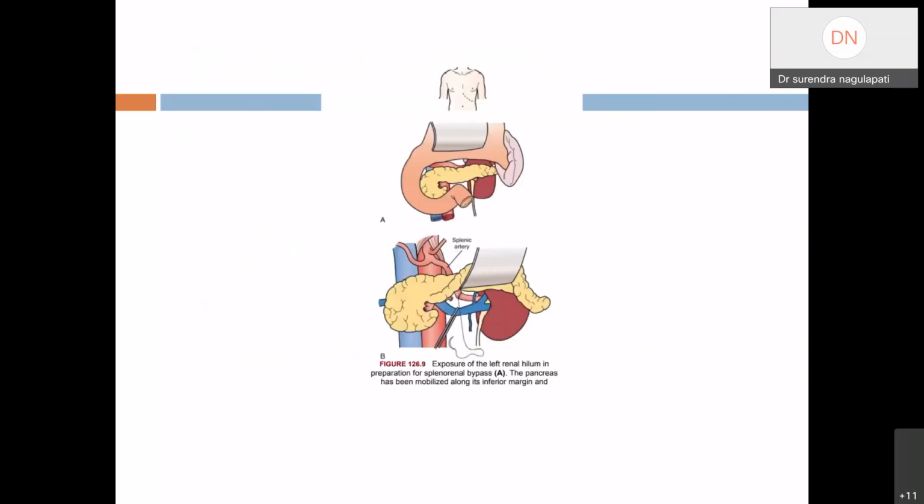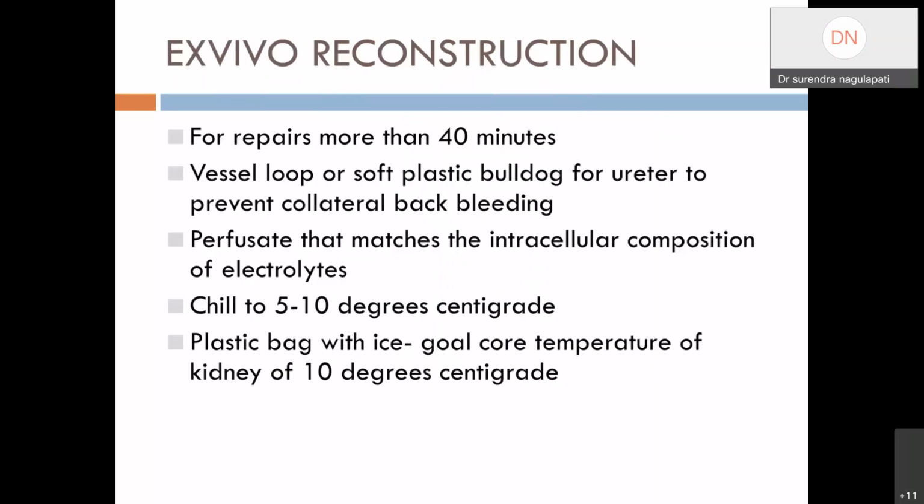This is the image showing the exposure of the left renal hilum in preparation for splenorenal bypass, and the pancreas has been mobilized along its inferior margin.